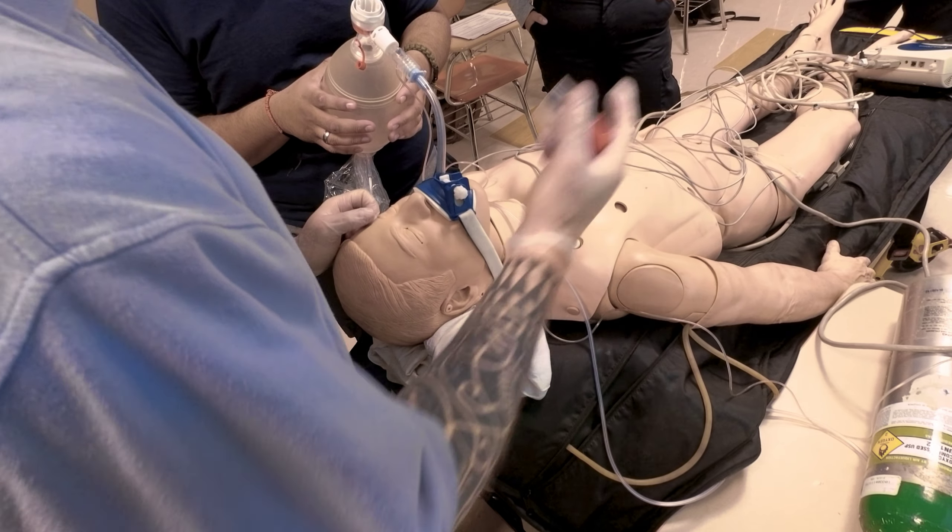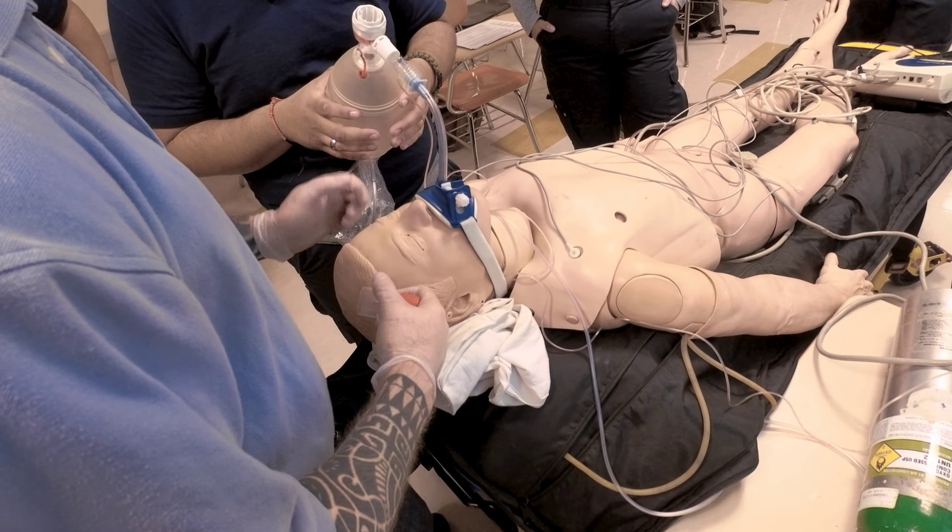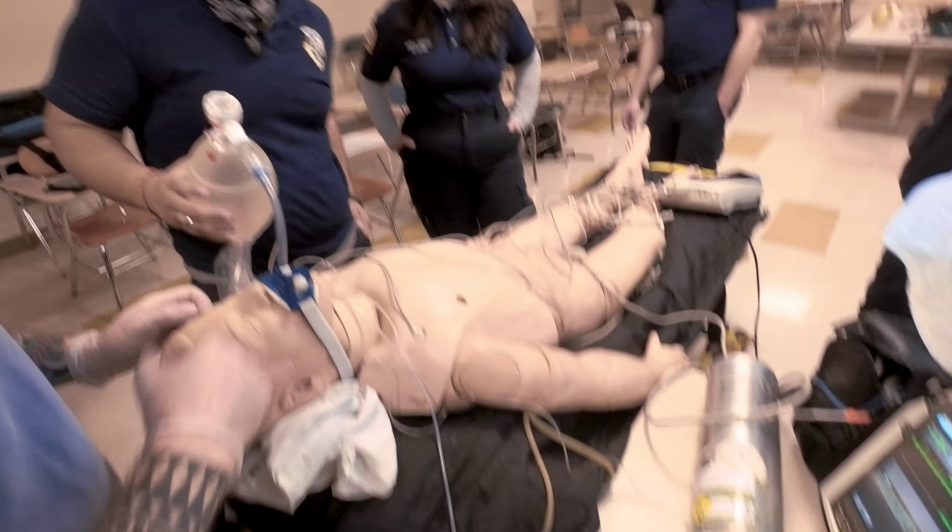The three-minute pre-oxygenation — is that a hard-and-fast rule? If you have a patient with ARDS who needs PEEP to stent the alveoli open, and you ventilate for three minutes but the pulse ox is not improving, connect your PEEP valve and dial it to five to ten. If you don't have that device, get the saturation to the highest you can and then go with your procedure. All right, thank you, we're going to break and continue.